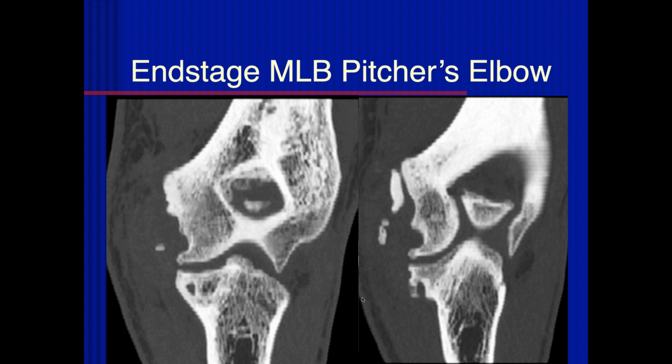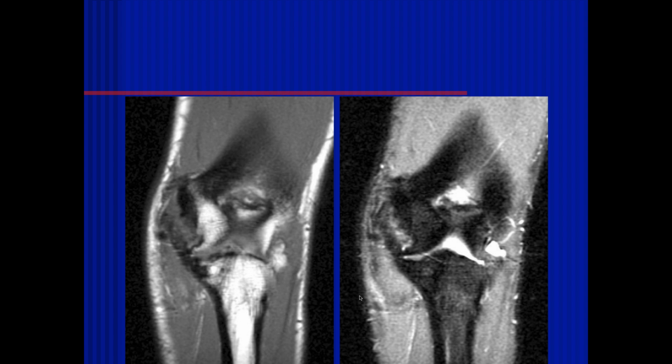Right. Jim. Yes, I was wondering on that MRI with the ulnar graft, the thickening and increased signal there at the medial epicondyle, if that was just graft degeneration or some partial tearing. And generally, when you get this much degenerative disease and interstitial tearing, it doesn't have the rigidity and strength that it normally would have, and therefore, when you put valgus load on the elbow, it gives, and that produces a kind of instability which leads to posterior impingement.